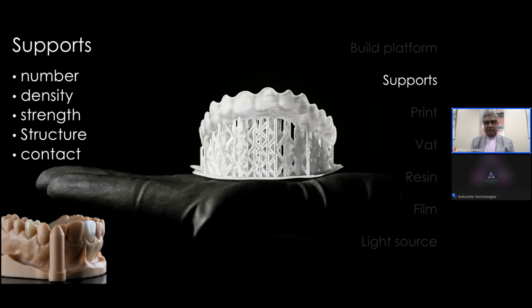And some of these things print better when they're printed at an angle, because the cross section of what the printer is dealing with at any given time with one layer is then small, as opposed to something that's flat. And so supports are best generated now by the Alpha AI premium software. But when we had just Alpha 3D, we used to do a lot of manual supports.